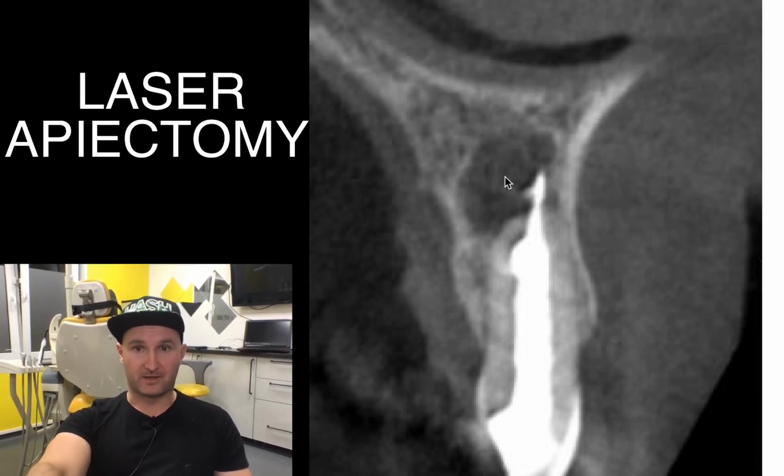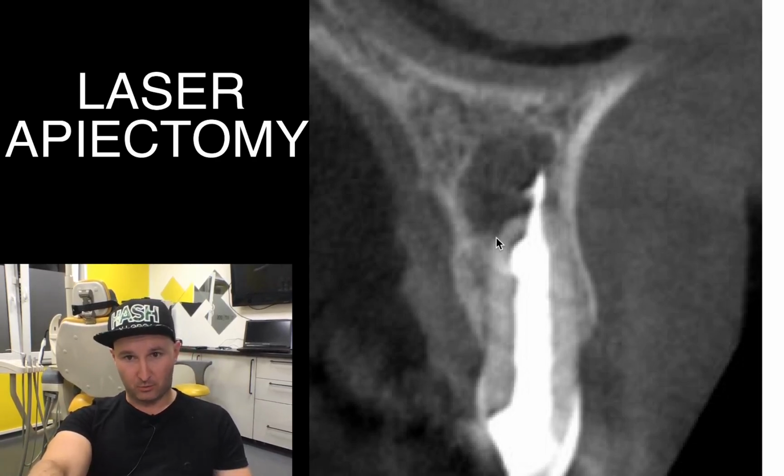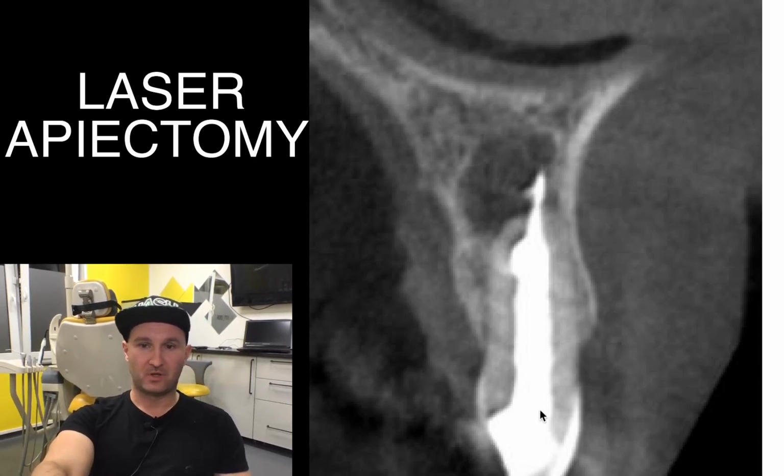So with this examination we came out with a treatment plan. So we told patient that we are going to remove the filling material from the cavity. We are going to remove gutta percha from the root canal.